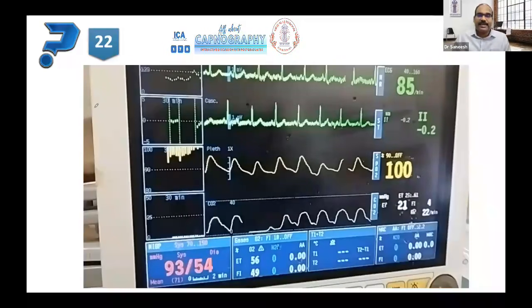I think in most regional anesthesia these days, people use the gas sampling EtCO2 port to see that the patient is breathing, which is not very reliable. That is one message. If it is there, yes, but if the tracing is not there, you don't conclude that the patient is apneic and jump into intubation, because of the sampling error. If sampling is proper, you give respect to the tracing value and trend.